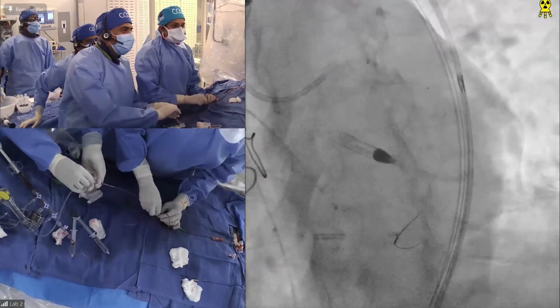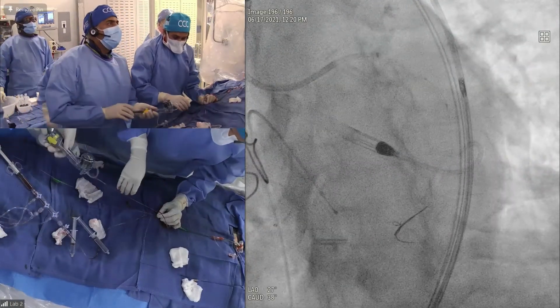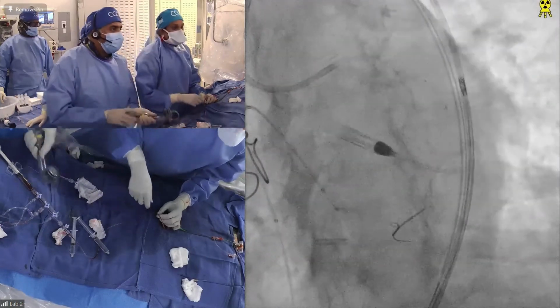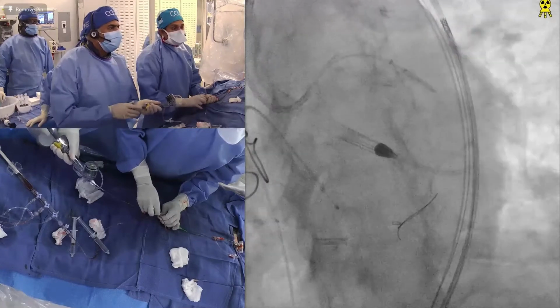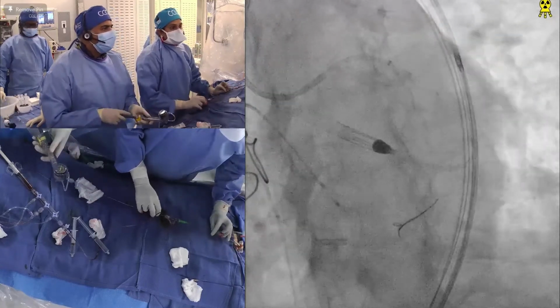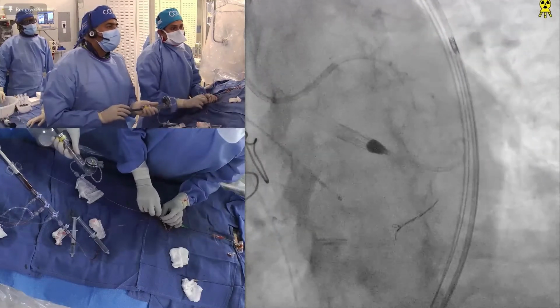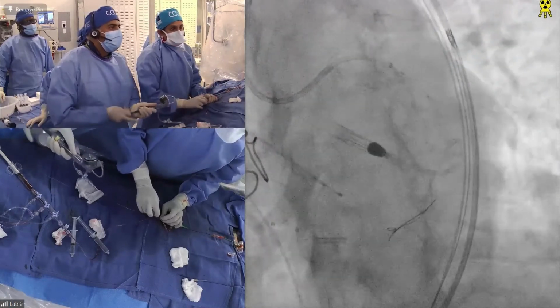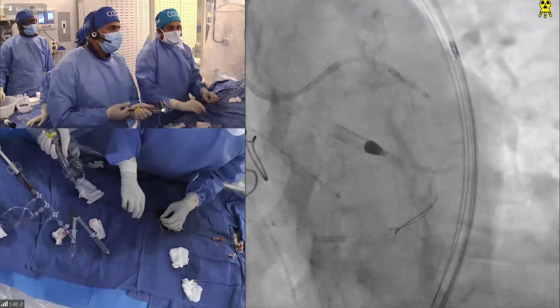Okay, go right up. What balloon is that now? This side is compliant again. Okay, go up. Maybe you could roto past once they dilate, then we go to the other room. Yeah, that's another thing. Yeah, no, that's okay.